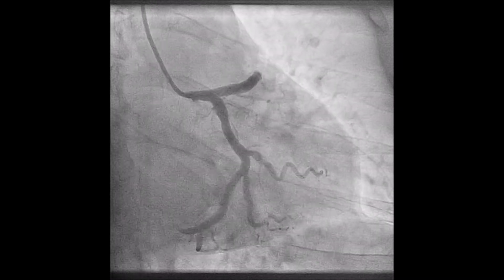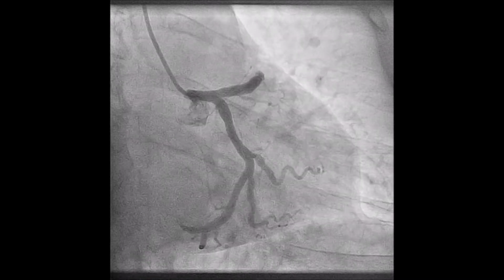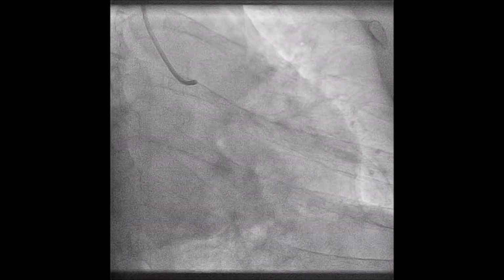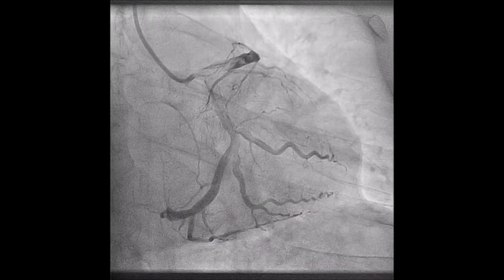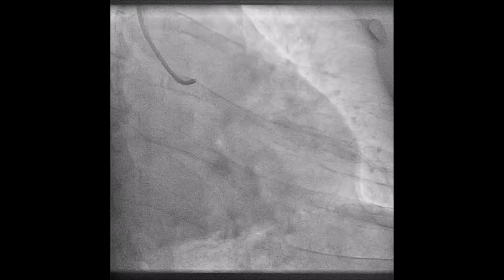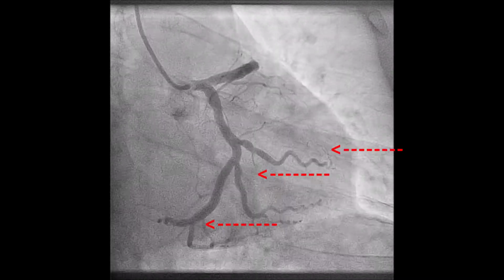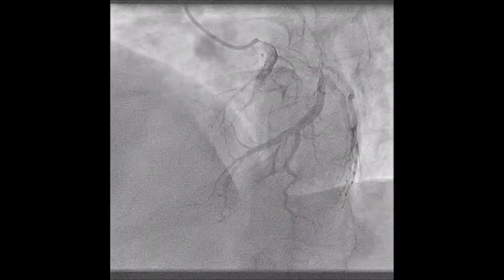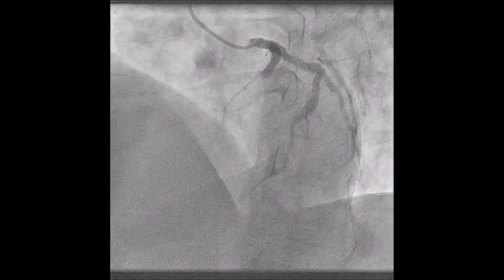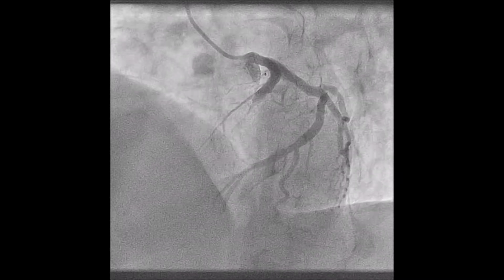As you know, the left coronary tree bifurcates into two branches, the circumflex and the anterior descending artery. So, we can see that the circumflex is a great caliber blood vessel and of good development that is also permeable, and it does not present angiographically significant lesions. In this way, it is important to point out that the circumflex presents three big marginal branches and a posterior interventricular branch, motives for which we can say without fear of erring that this patient presents a left coronary dominance.